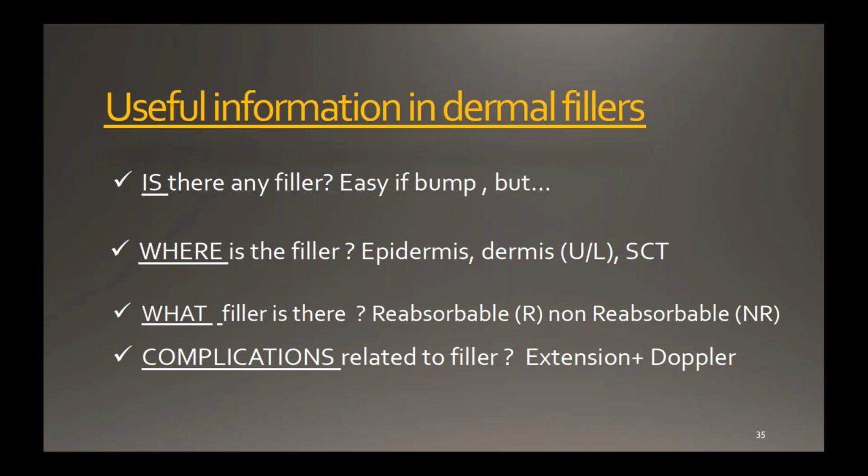Then what is the information we can offer to our dermatologists that are interested in assessing a patient with fillers? First of all, if there is any filler, we can see easily if there is a bump, but sometimes the filler is not so evident from a clinical point of view. And I tell you, most of the patients are going to tell you that there is no filler, that they have never had any filler, because I don't know if it's something related to shame or something they want to hide from their wives or husbands. I don't know, but people tend not to say to their physicians that they have fillers.